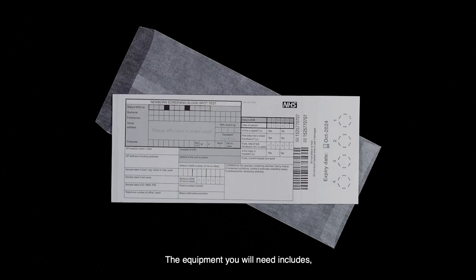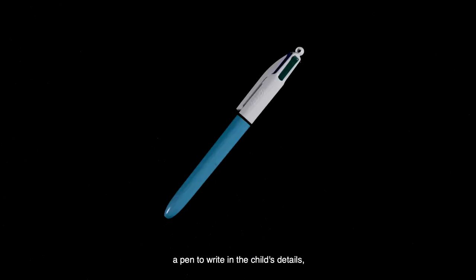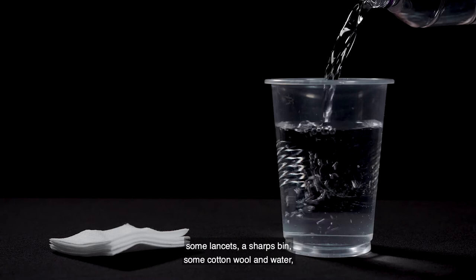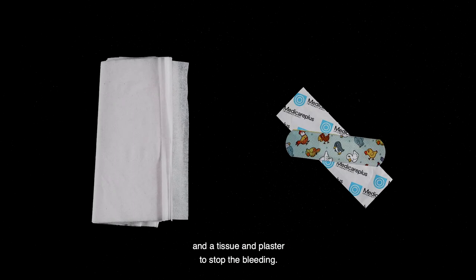The equipment you will need includes a blood spot card, an envelope, a pen to write in the child's details, some lancets, a sharps bin, some cotton wool and water, and a tissue and plaster to stop the bleeding.